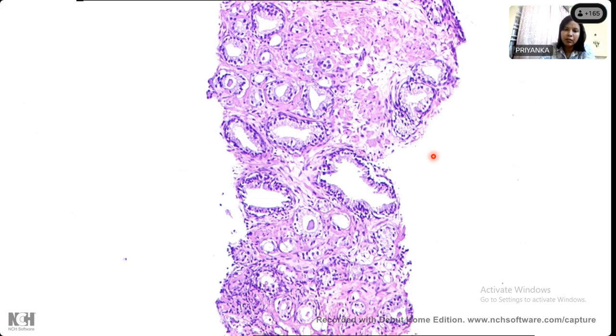Okay. So see, this is your benign gland. You can again see bilayering maybe here. The first sign which at least I look for when I look at a core biopsy is small rigid lumen glands which are infiltrating between the large benign looking glands. You understand? Small rigid gland. You see this gland, this gland, this gland. At low power itself, if you start seeing such glands, please start looking at those glands at higher power.